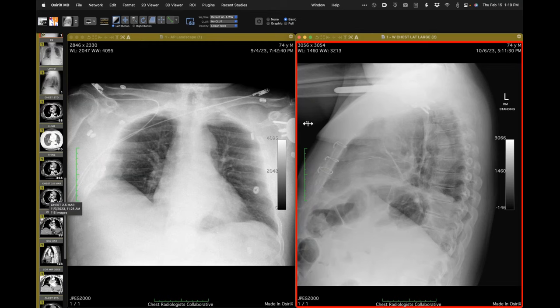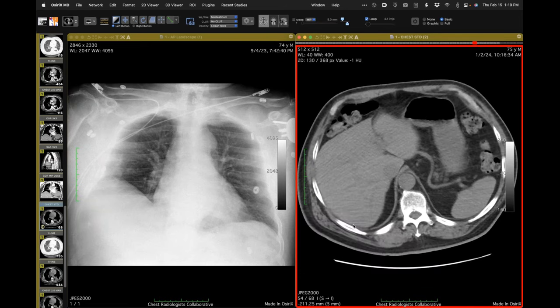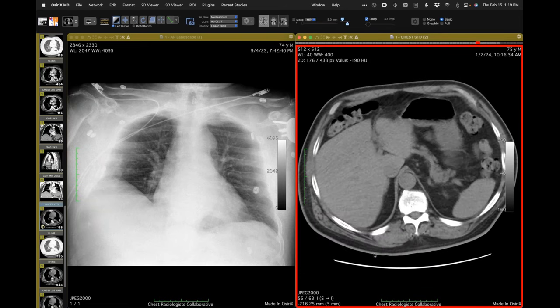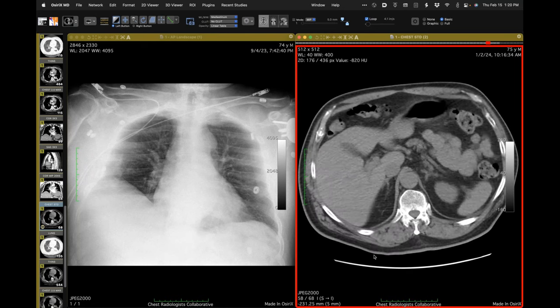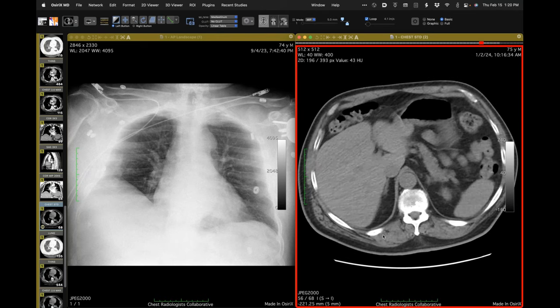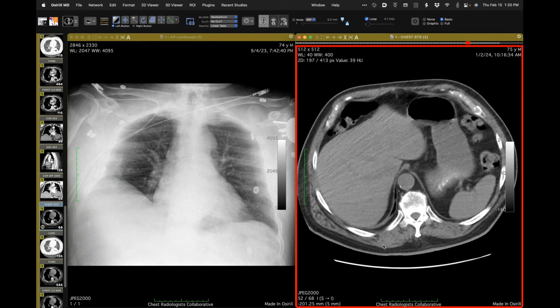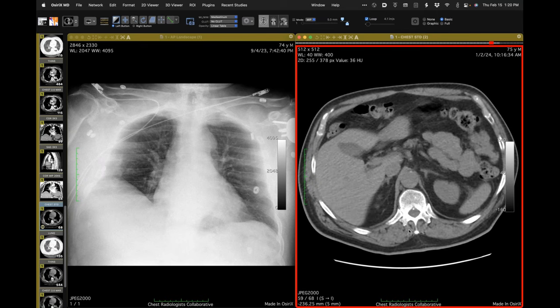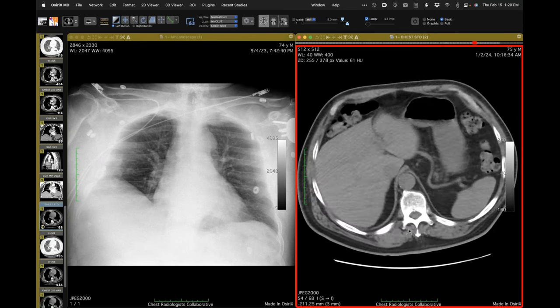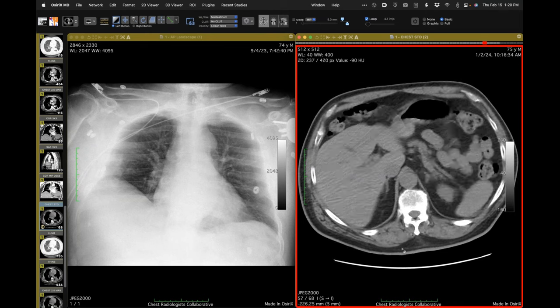That's a nice example. Sometimes we see this immediately post-op — when do you decide it's not transient but truly a phrenic nerve injury versus just temporary palsy? Here we're seeing the evolution of this atrophy over months, from September to now. It takes time to develop. It's the appearance and evolution over months. A fluoro was done again by somebody else showing the left hemidiaphragm not moving properly.